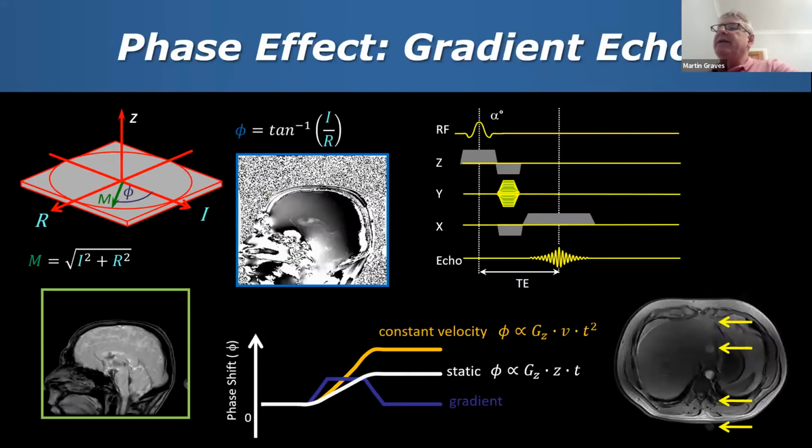Well, in many cases, this is due to phase shifts during the acquisition. Now, I hope I'm not baffling people too much, but when we acquire our MRI data, we actually acquire it in what we call quadrature. And after Fourier transformation, this quadrature essentially means that we acquire complex k-space data. So if people remember back to complex numbers in school, thinking that you'll never have any use for them ever, well, here's a real practical application of using complex numbers. So we acquire both real and imaginary components.